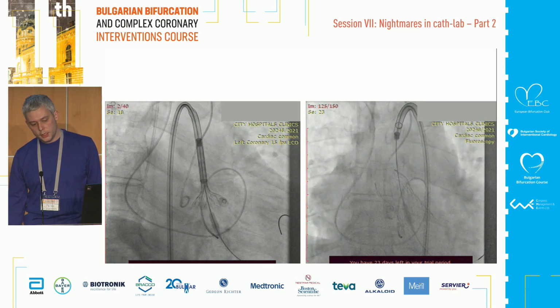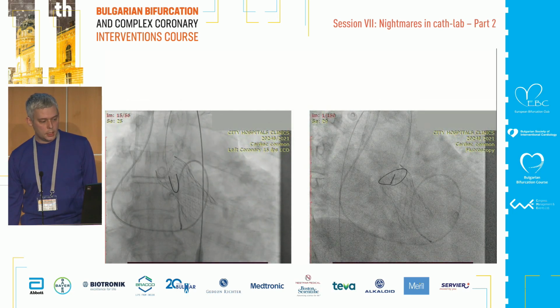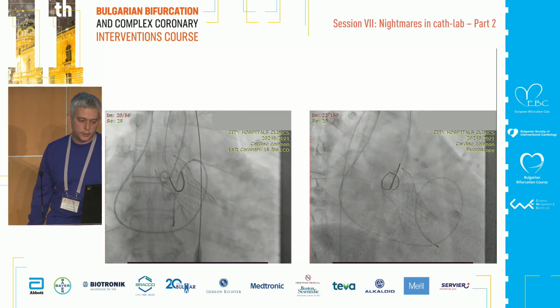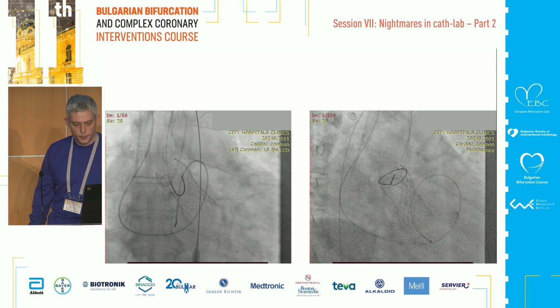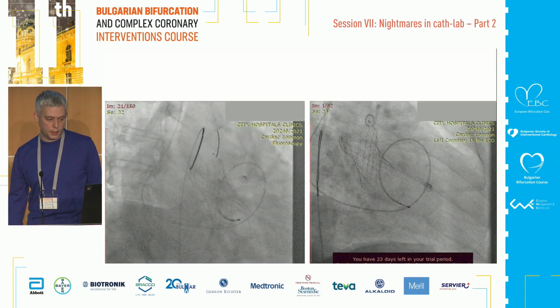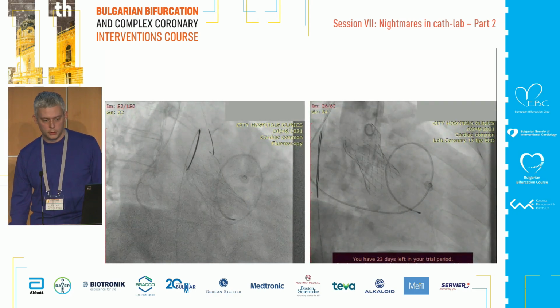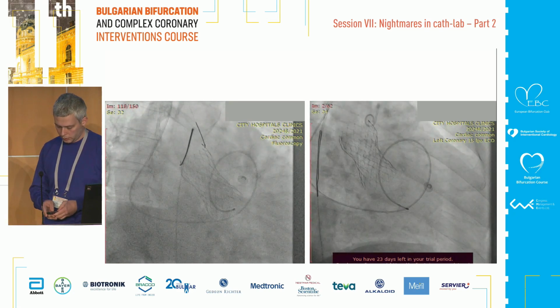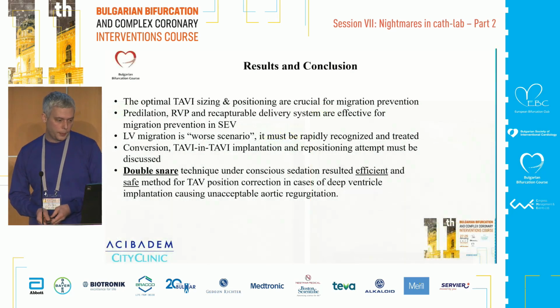There is a good release of the valve, but after that there is a movement, migration of the valve into the left ventricle. So we do the same thing, traction of the valve, and only mild aortic regurgitation.